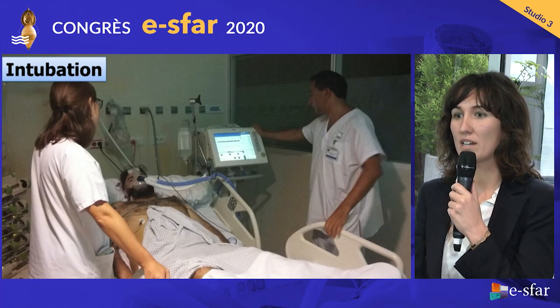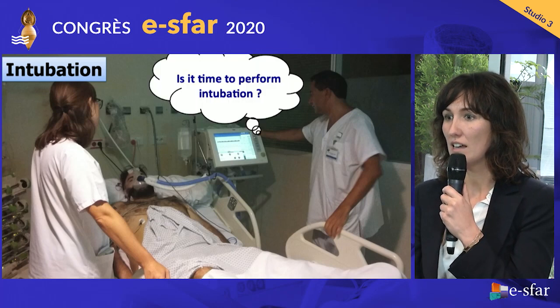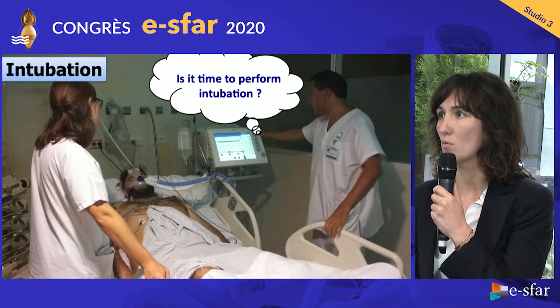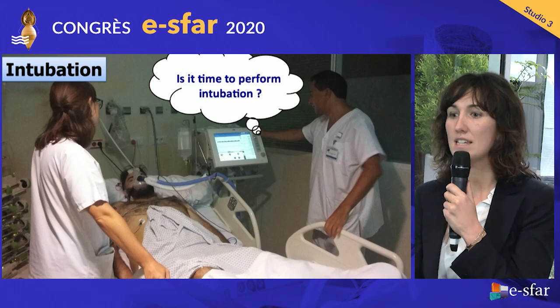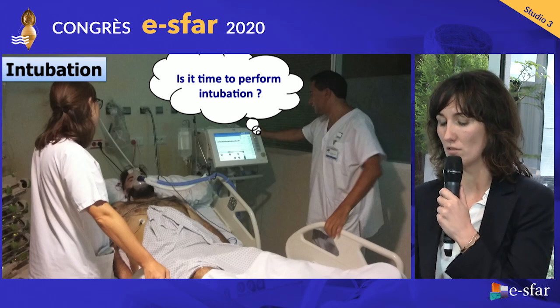Finally, we cannot forget the intubation, and never delay intubation when needed in acute respiratory failure. As said Professor Jaber, is it time to perform intubation?